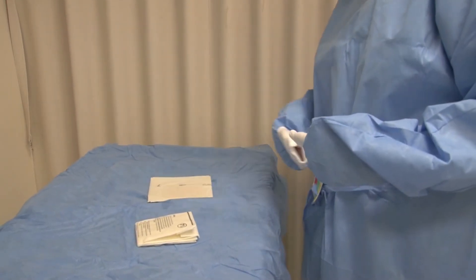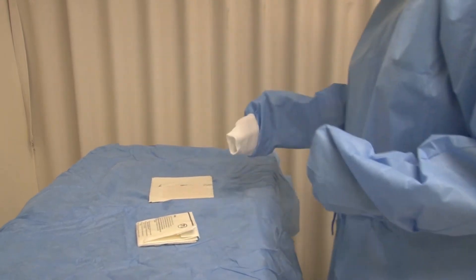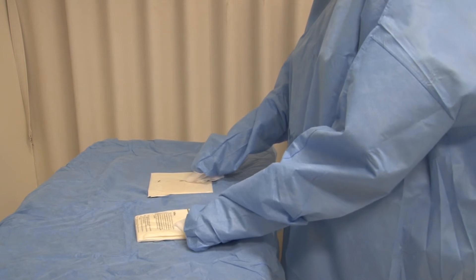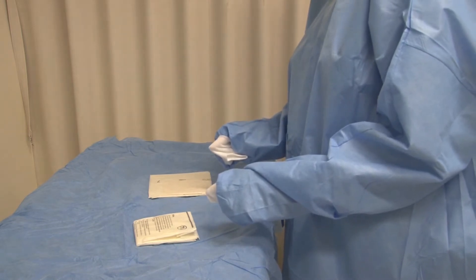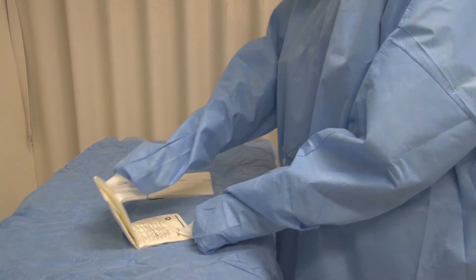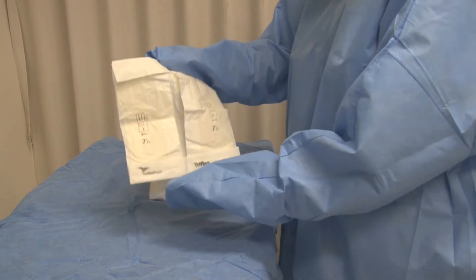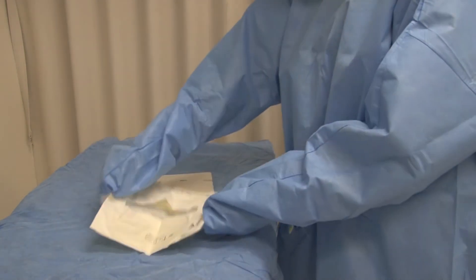The Scout nurse has done me up and I'm ready to commence gloving. Make sure the distance between yourself and the trolley is good — you don't want to be hugged up against the trolley, that's not a safe distance. Give yourself a little bit of space and arm room to move. I've got two different sorts of gloves here to demonstrate how to open the different sorts of packaging. Apply the principles of what I'm teaching you to any sort of packaging you come across in the perioperative suite. We open it — one and two — and you can see written there it says left and right.